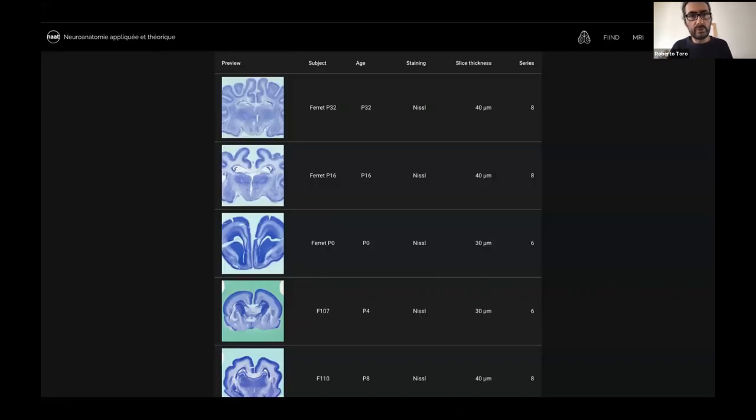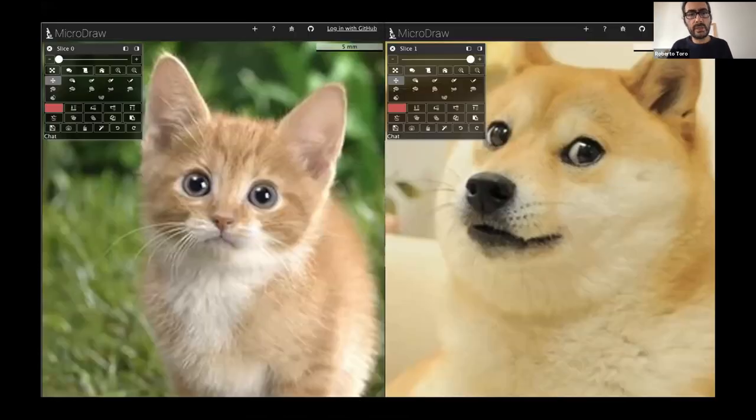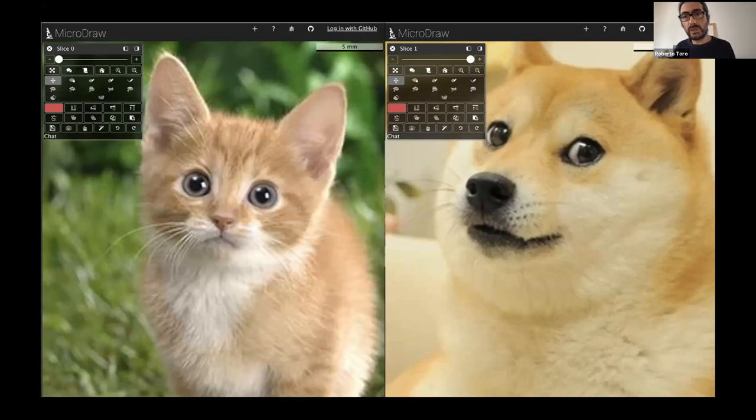This is an example of the table and then you just click on any of those images and they will be immediately available for working on them. So how do you get data into MicroDraw?